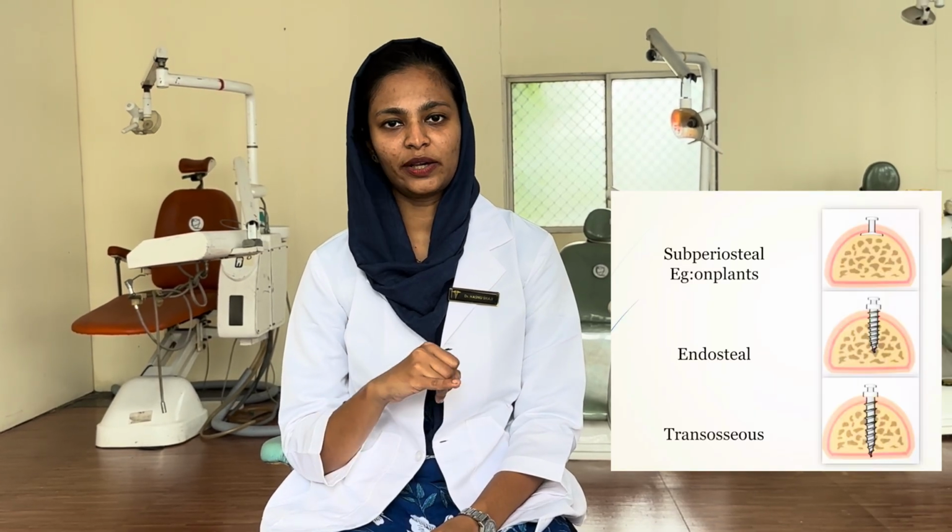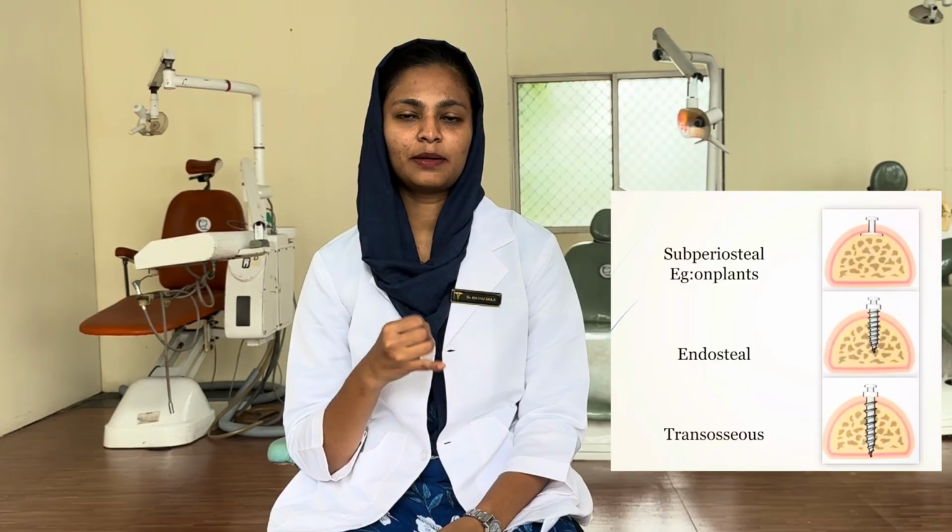Next one is the classification of TADs. First one is based on location. It can be transosteal, subperiosteal or endosteal. Second one is based on duration of usage. It can be long term or short term. Third one is based on location. It can be intraalveolar or extraalveolar.